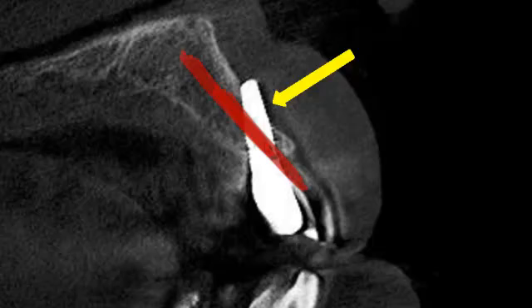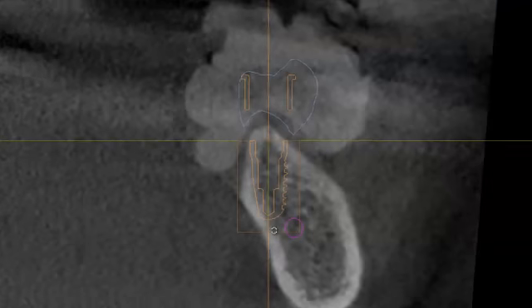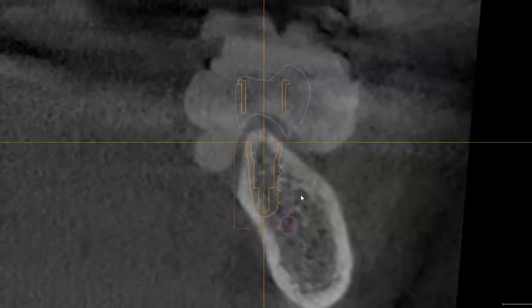With the 3D scanning technology, we can really avoid these complications. We know exactly where we're going before we go in there, and we can do these cases. An implant like this is done in about 15 to 20 minutes with very little local anesthesia, and it's able to accomplish all our goals of getting that implant exactly where we want.